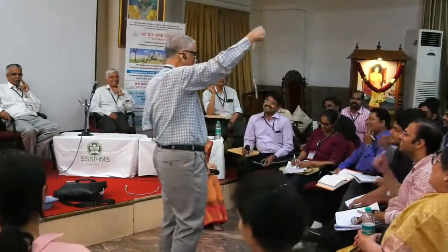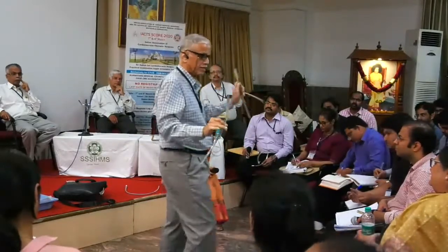And third is connector. This doesn't have a built-in connector. You may have one of the cannulae with a built-in connector. See, this cannula is with a built-in connector. You cannot remove it. So when you don't have a connector, you will tell the perfusionist that I require a connector. And typically connectors are 1/4, 3/8 and 1/2. So 4/8, 3/8, 2/8, and in extremely small pediatric cases, 1/8. With this knowledge, now we will start.